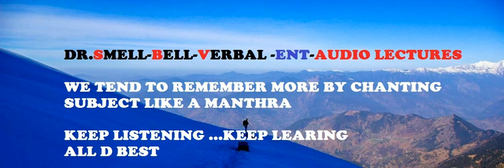Next, reduce the facial ridge. The ridge is the posterior meatal wall that overlies the vertical portion of the facial nerve. Ridge is vertical.